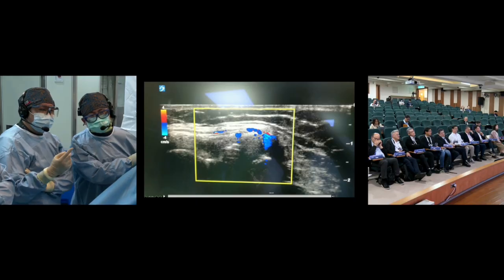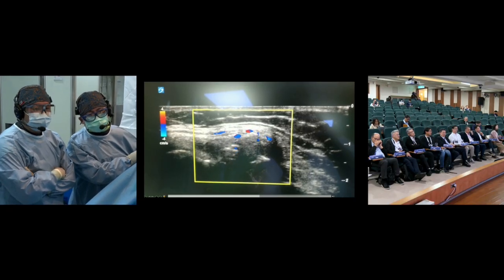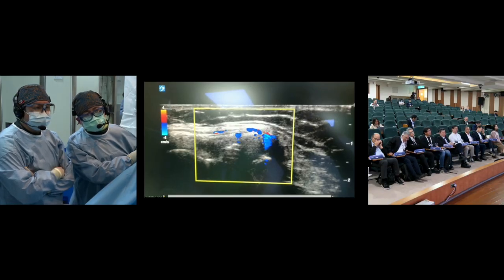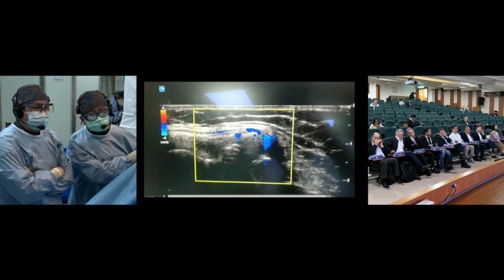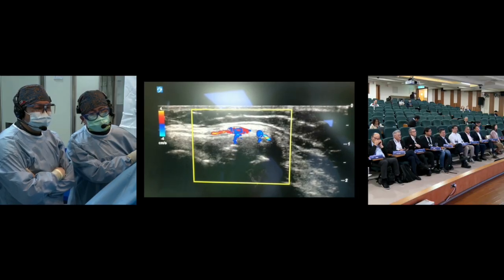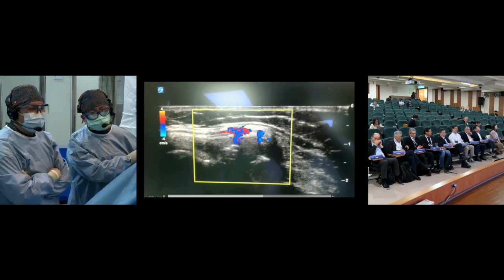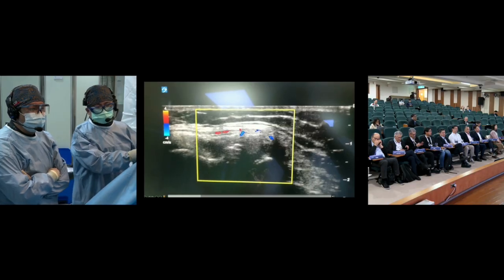Okay. So according to the color Doppler data, we can find very abundant angiogenesis around the cavity of the joint. We can also see the X-ray data from the AP and lateral view. We can find this patient has KL grade 4 OA. Because she has multiple comorbidities, we decided to try to help her with this procedure.